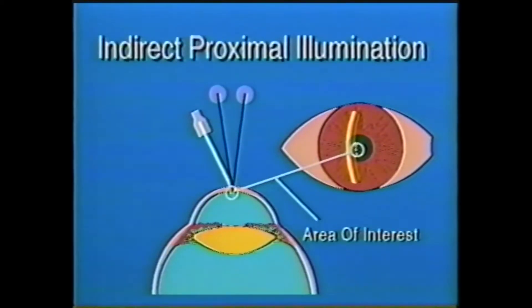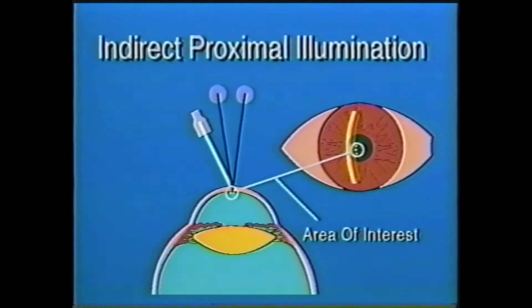Three, indirect proximal illumination. This maneuver highlights the object being evaluated at the side of the light beam, not directly where the light is focused, such as these KP or keratitic precipitates.